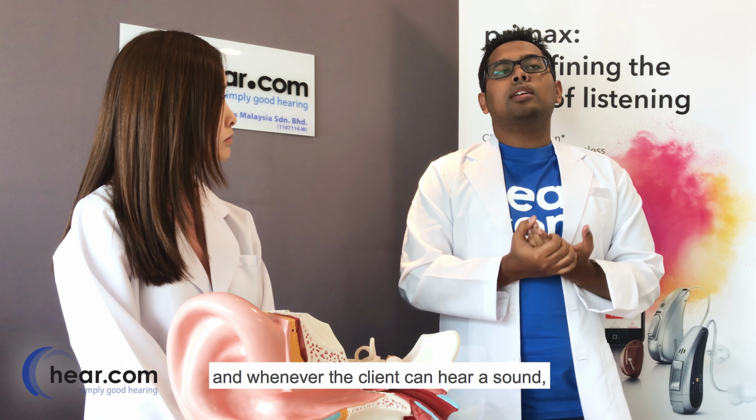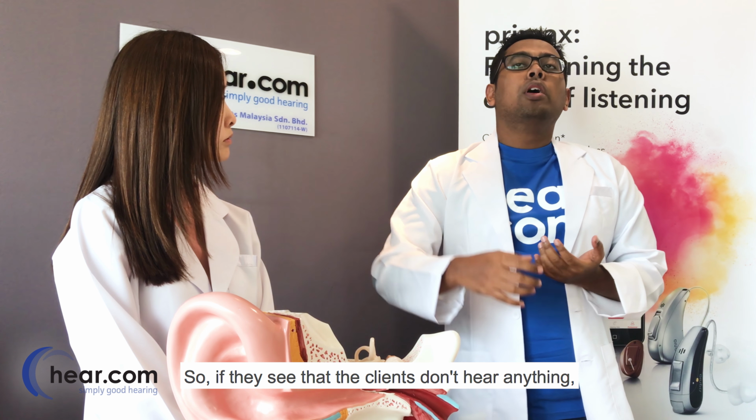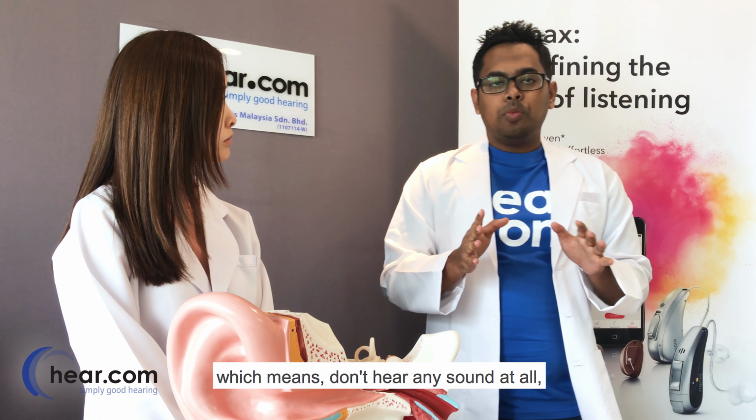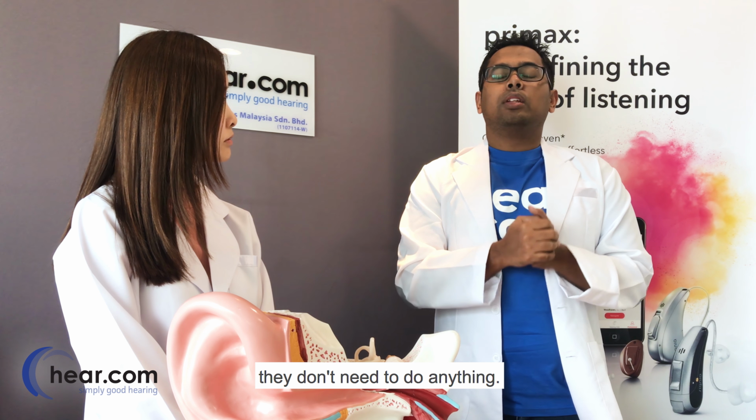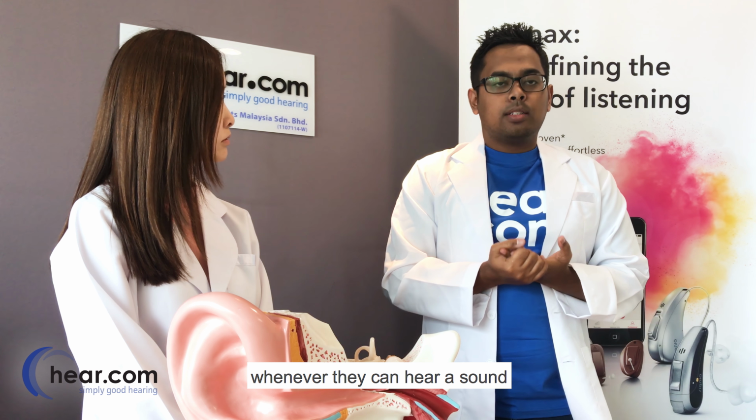And whenever the client can hear a sound, they need to press the button to respond to it. So if, let's say, the client doesn't hear anything, which means they don't hear any sound at all, they don't need to do anything. They just need to respond whenever they can hear a sound.